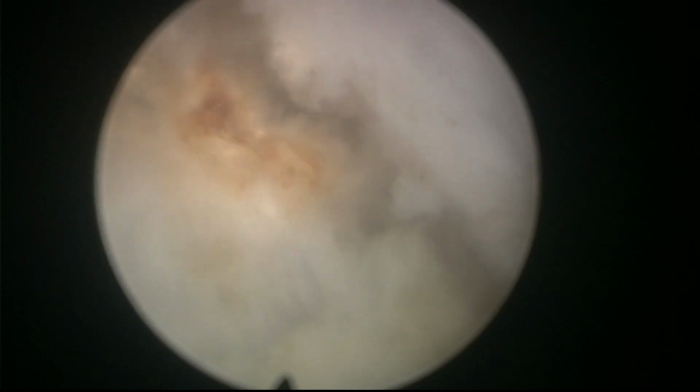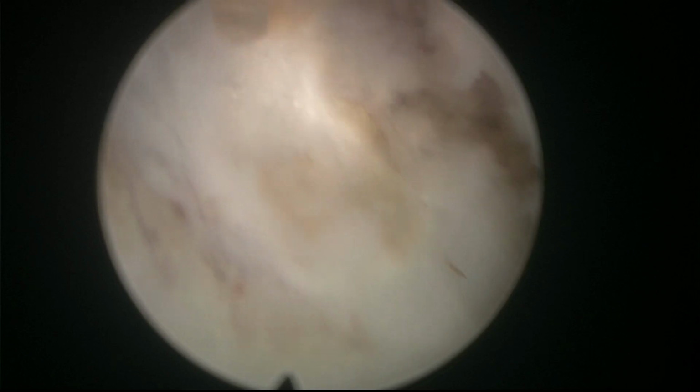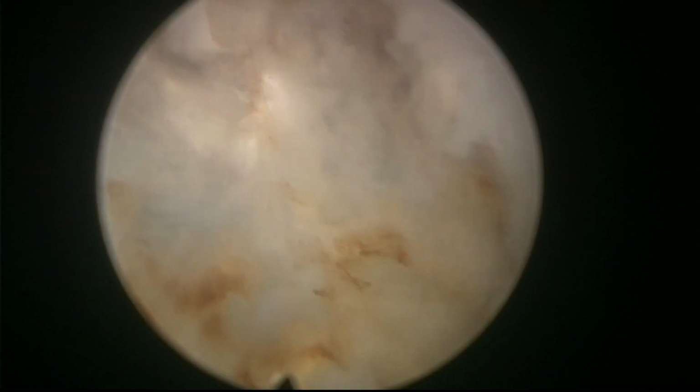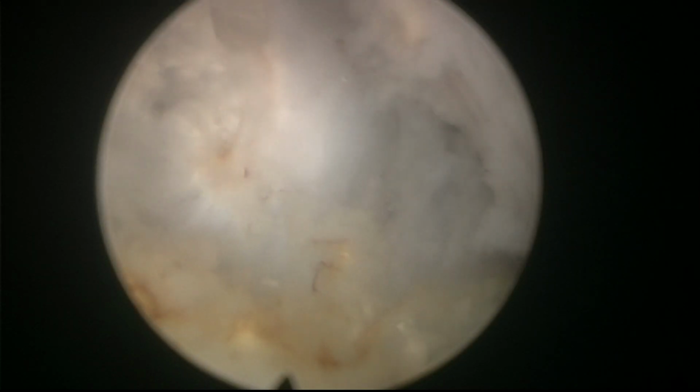A little bit of yellow tissue there. Here, I don't like that one. Let's come this way. Maybe you see sometimes. Of course, here you start to see that the plane is maybe too deep. So, but again, as I said, there's nothing wrong in challenging your previous plane, in exploring a little bit.